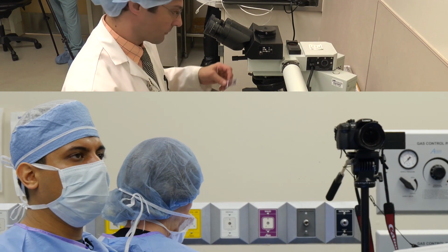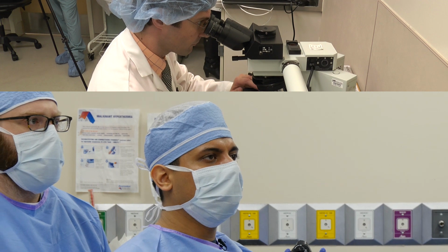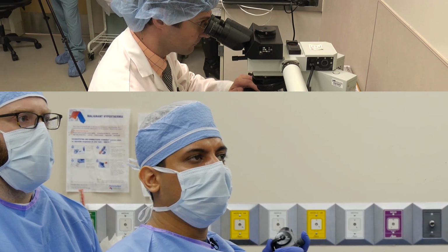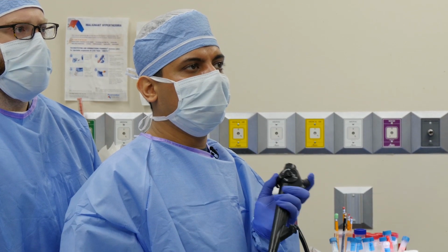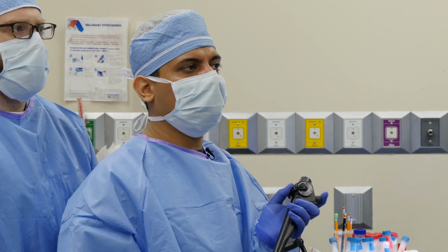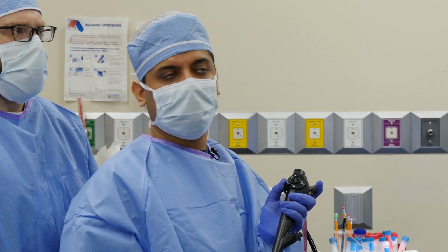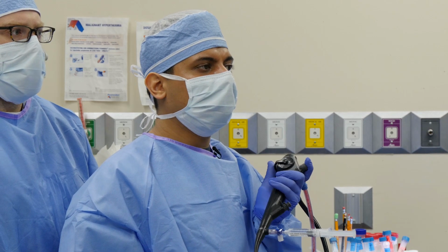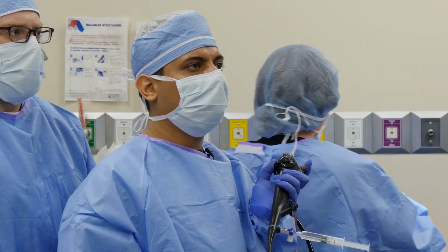Yeah, so that's the PA right there. Yeah. So that's the 4L. So if you come up, now that's the arch of aorta. Okay. So that's the PA. Now if you go further down, then yeah, that's a 10 actually, which is uncommon, but it actually looks suspicious. So it might be positive there. But anyway, so we are going to 4L now.